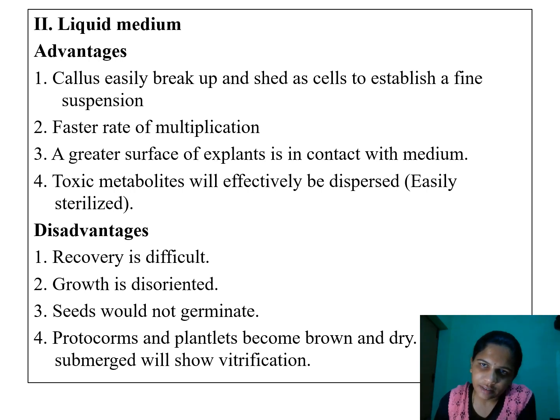Recovery is difficult. Suppose there is any damage to the explant, that recovery is difficult. And growth also we cannot expect. With solid medium it will hold, the anchorage will be good, but here that is not the case. And if we place any seeds in this liquid medium, they will not germinate. It is well suited for callus culture.